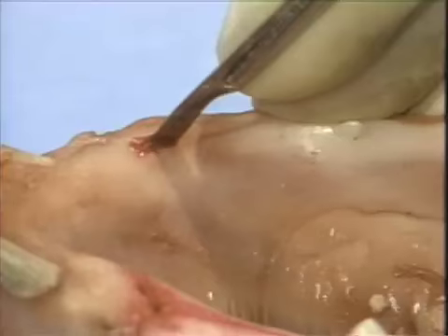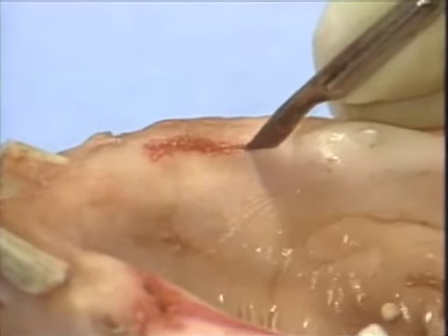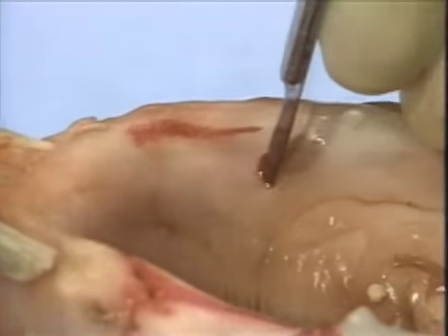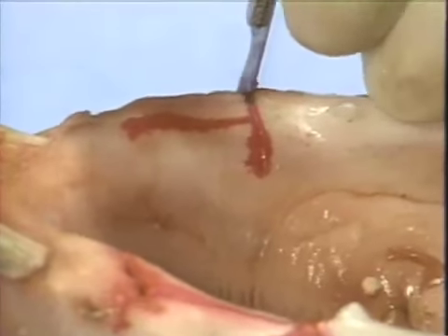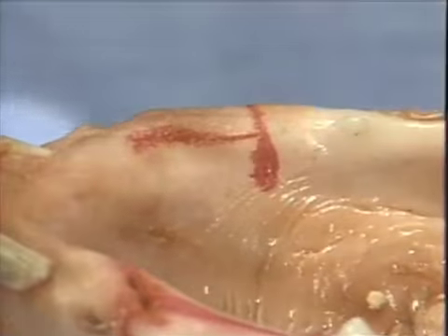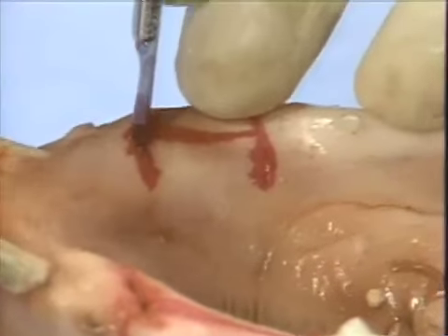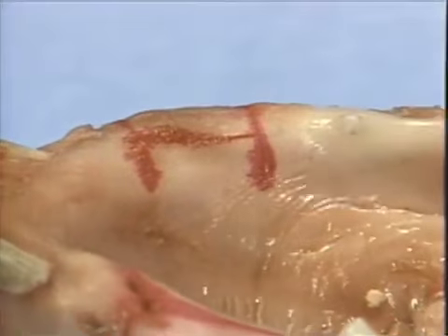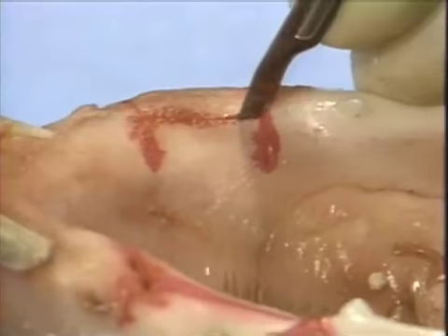We'll now demonstrate the elevation of a split thickness flap. The initial incision is exactly the same, running from mesial to distal, from crestal gingiva through and down to crestal bone. In this case, we will place 2 parallel vertical releasing incisions because we intend to apically position the lingual flap in this demonstration. The parallel nature of the vertical releasing incisions allows this repositioning.